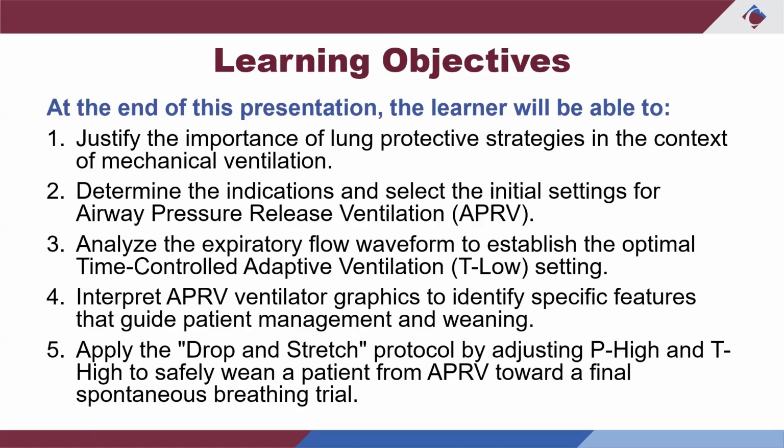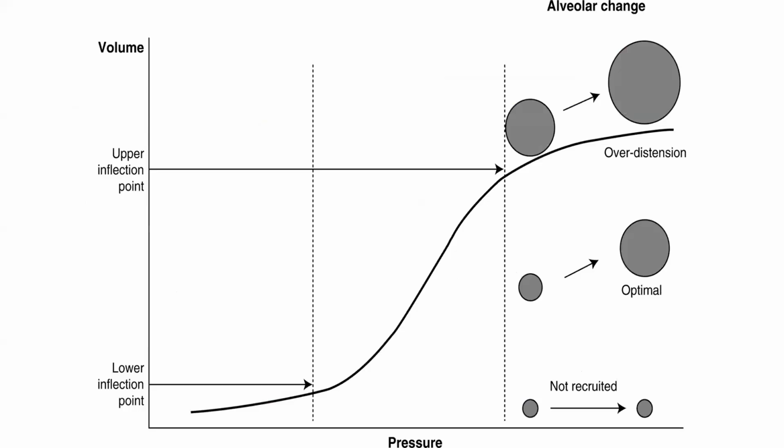I said, okay, how many of you use APRV or want to use APRV, but the doctors don't want to use it, or the doctors want to use it and you guys don't know how to use it? And the last question I asked them was, how many of you use it for rescue? And that's when a lot of the hands went up. So there's still, I guess, controversy about when to start APRV, and it still sounds like it's used as a rescue mode versus an initial setting. So hopefully I can paint a picture tonight about why you can start it earlier and you can wean from it. You don't have to change back to another mode.